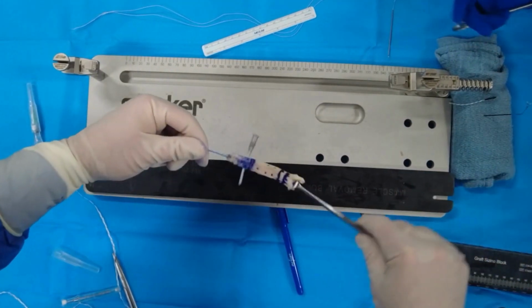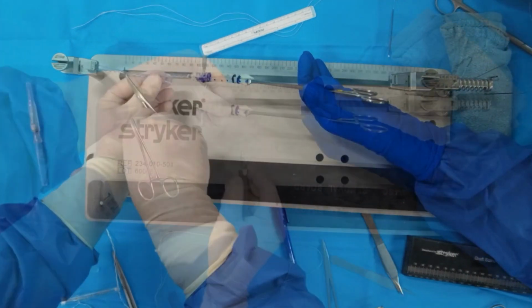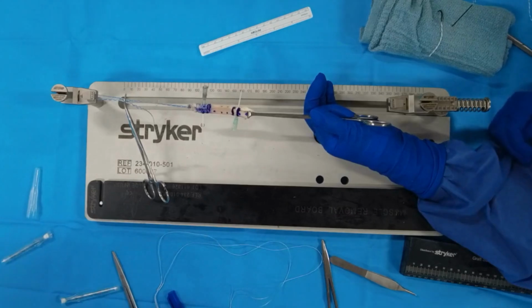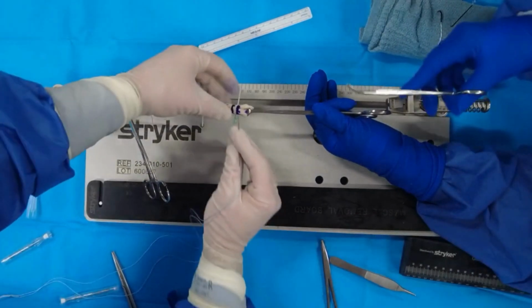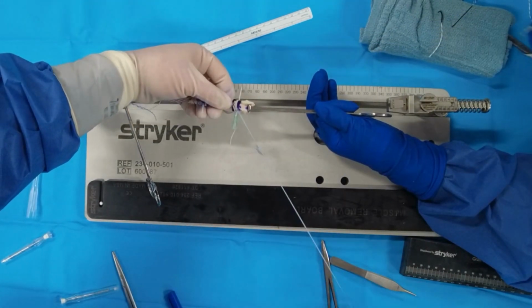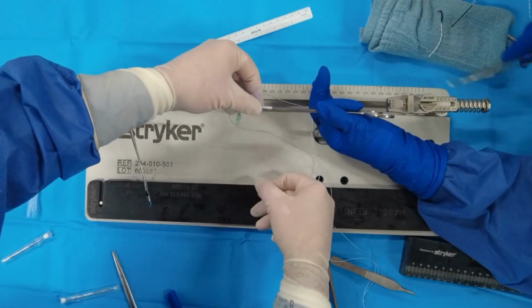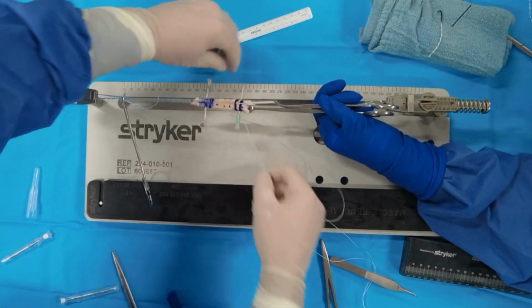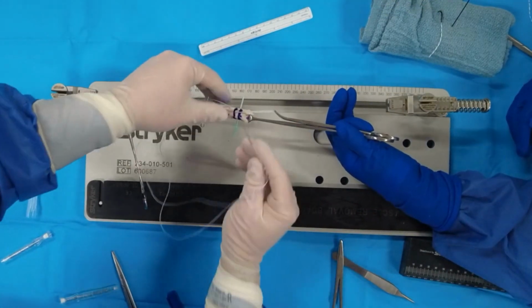So now I'm going to flip this around and secure our other side to the graft station. On this side, I am going to demonstrate the commercially available suture material that has the tape already swedged on. You'll see it's cut to length, so it fits quite nicely across the end of the quadriceps tendon. One of the benefits of this is that the suture ends are actually a little bit longer, which can become important in patients who have large thighs or larger body habitus, because you do need to find the suture ends outside the thigh, particularly on the femoral side.